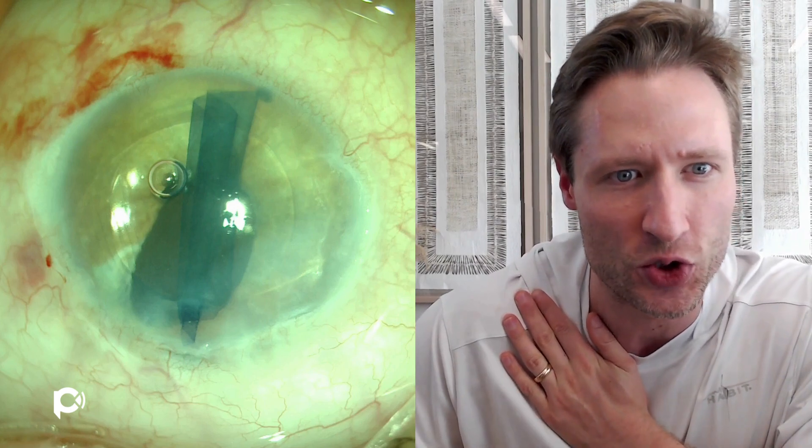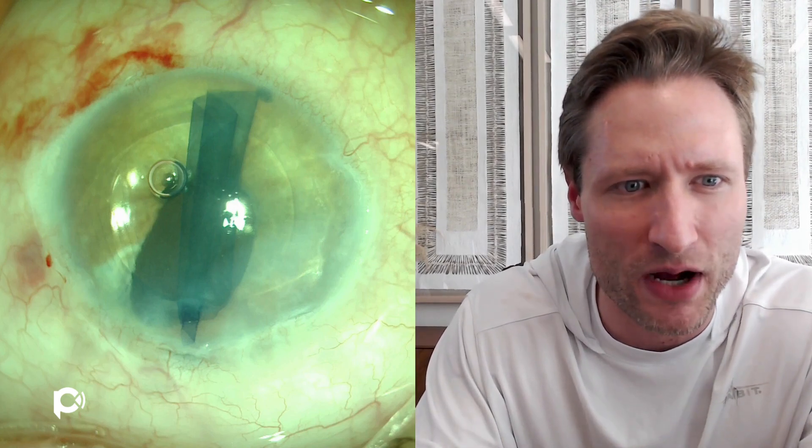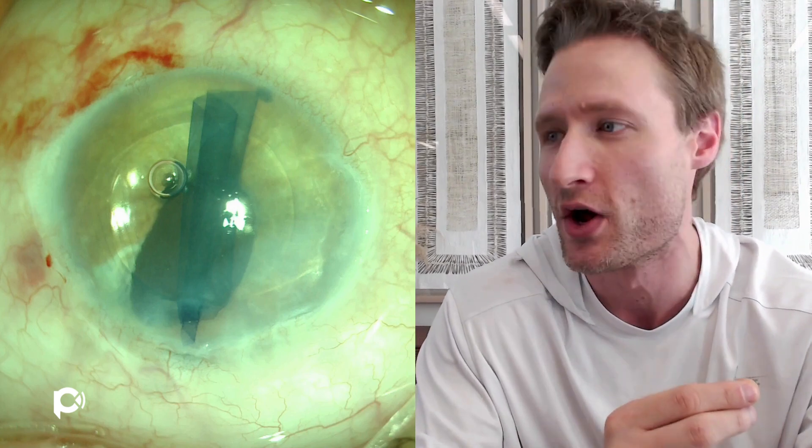I like using a large graft because the larger the graft, the easier it is to unfold if you have a deep or hyper-deep chamber. You can get interaction between the edges of the graft and the angle — the periphery where the cornea and iris meet — which is where the chamber is shallowest. A small graft floats in the deepest part of the chamber and is harder to unfold. You'll also notice an air bubble was injected along with the graft — this bubble must be removed before you can substantially unfold the tissue, because otherwise it competes for control over the tissue.